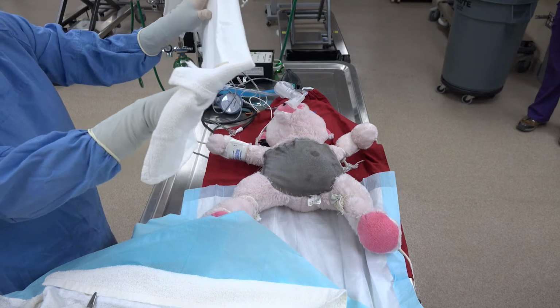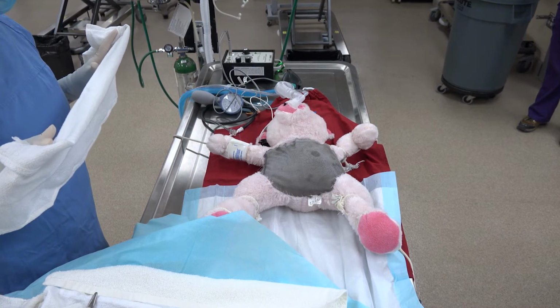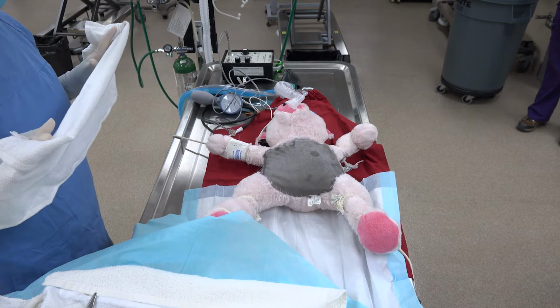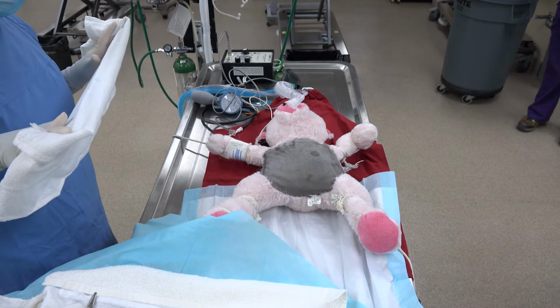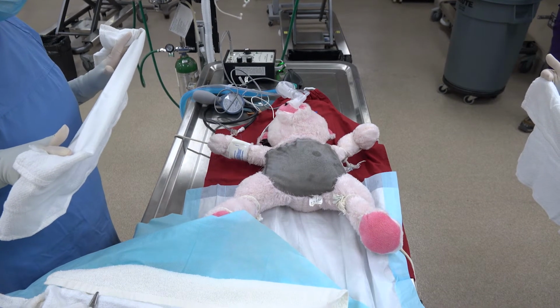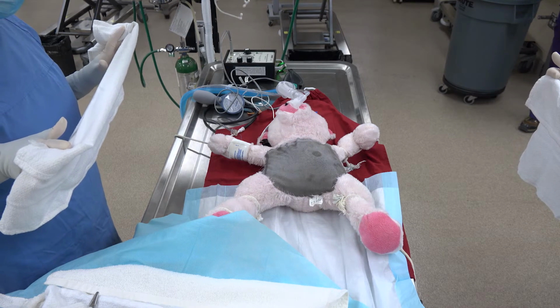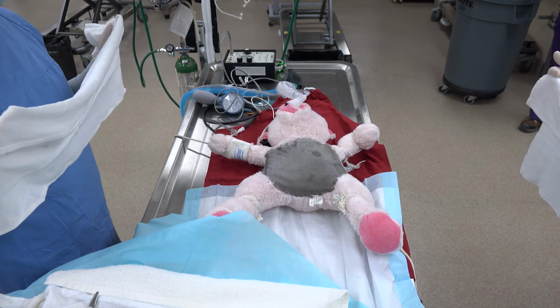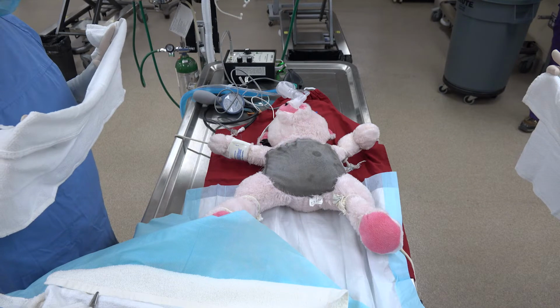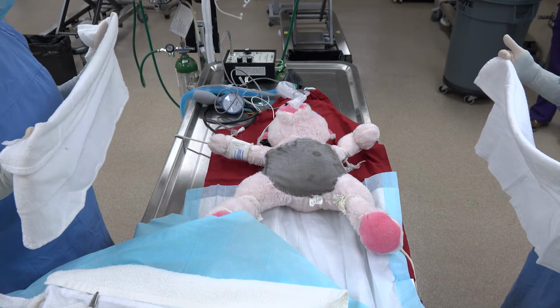So then what we're going to see is our patient here is on the table and it's been aseptically prepped by my pal, Dr. Spence, who did that while I was scrubbing initially. And so our patient here is completely ready to go, aseptically prepped. But I'm going to double check. I'm going to say, hey, Dr. Spence, is this guy ready for draping? I think we're ready. All right, that's fantastic.